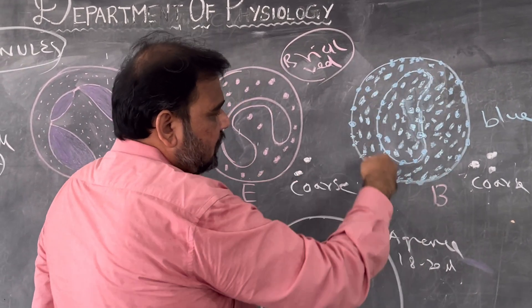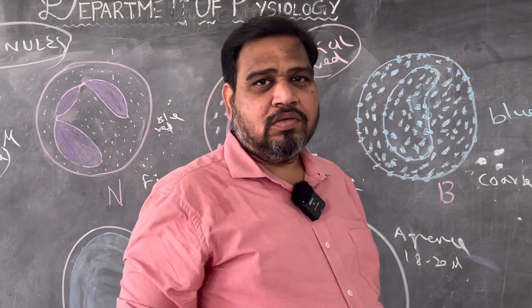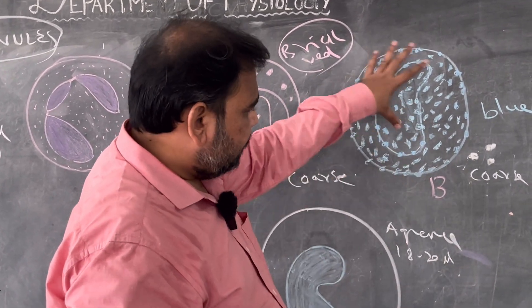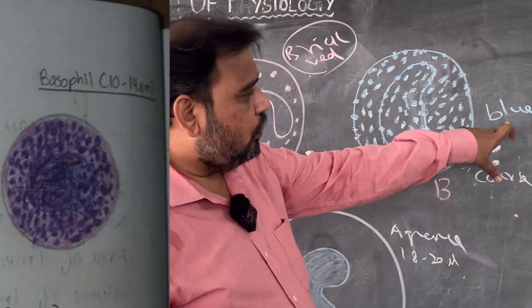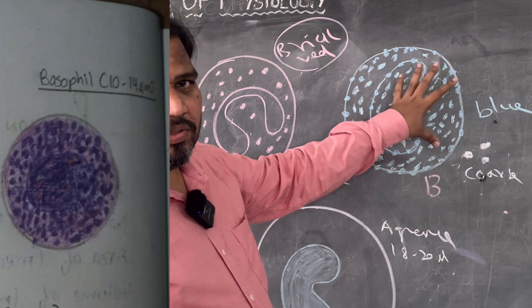The granules are so much that it is even around the nucleus. See the cell membrane, cell membrane are also full of granules. Or granules are so much that it is obstructing the vision of the nucleus as well as the cell membrane. Main thing: blue, coarse. Note it down, this is basophil.